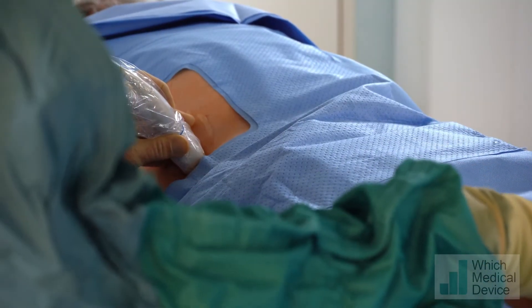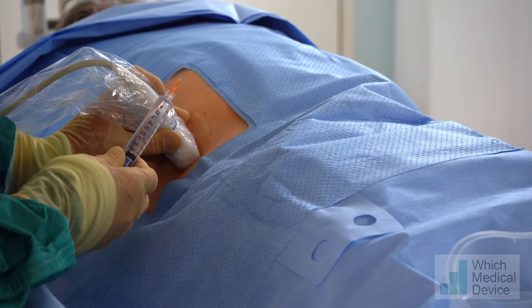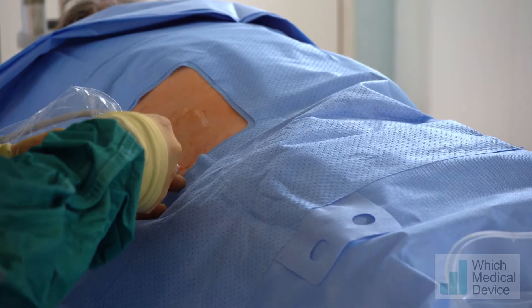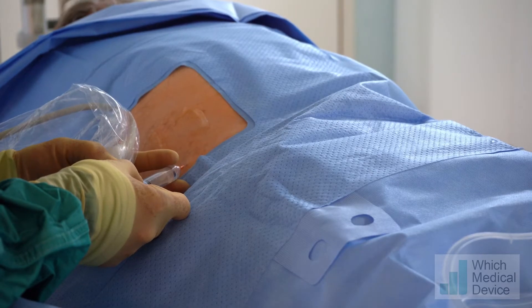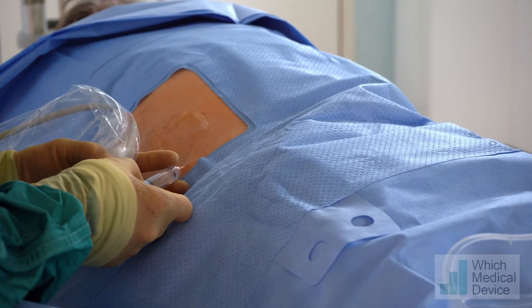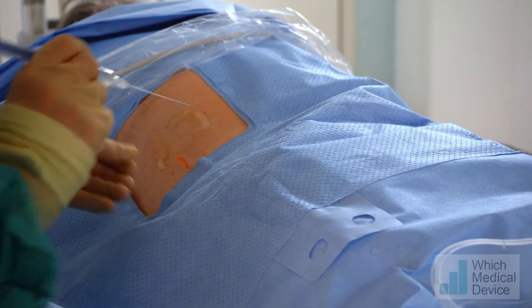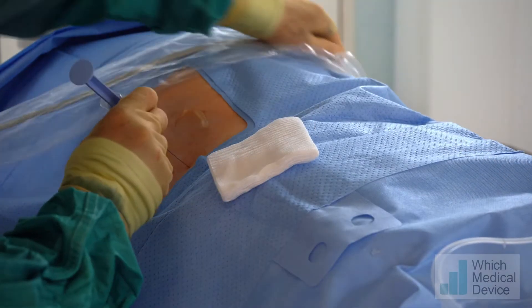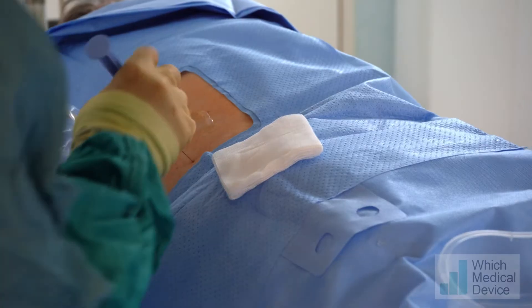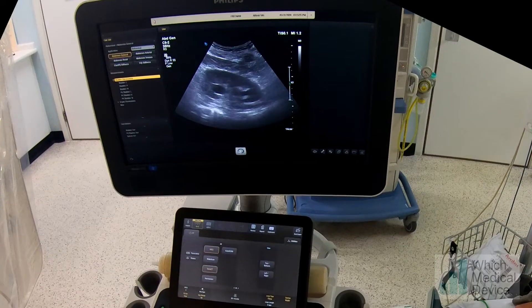I'm going to put some local anaesthetic in now. This is lidocaine mixed with a little bit of bicarbonate to neutralise the acidity. We're then going to swap that for spinal needles so we can go down to the kidney with the anaesthetic, getting nice infiltration right the way down to that renal capsule.